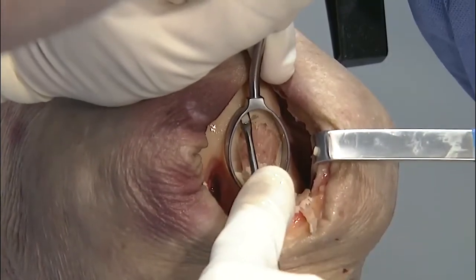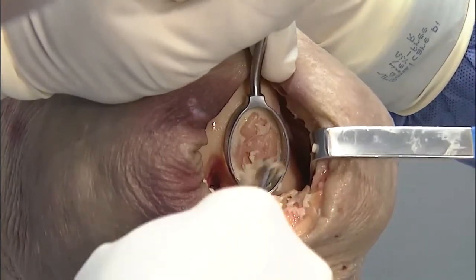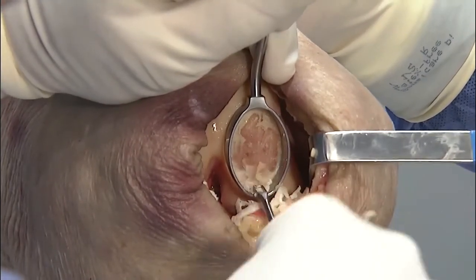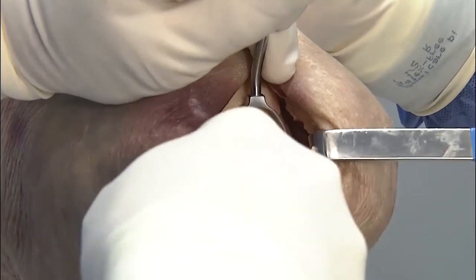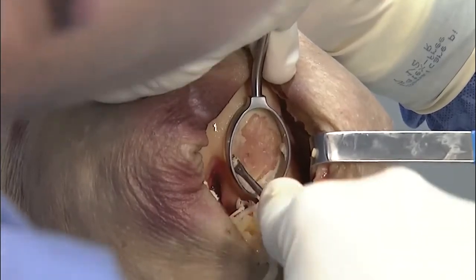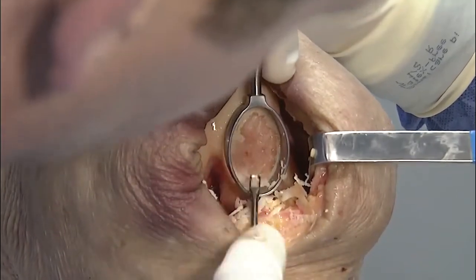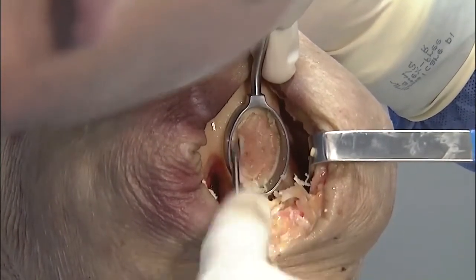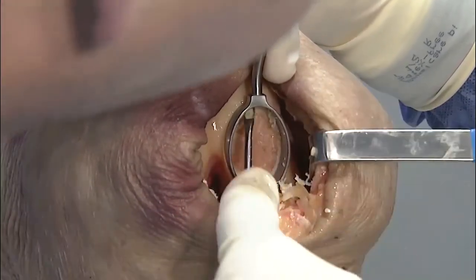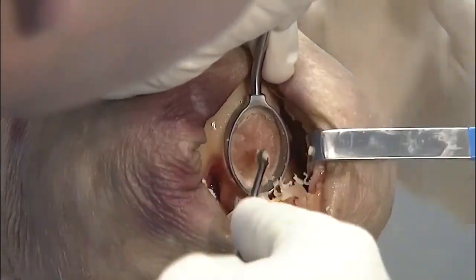So what level, I know you're going to get to it, but what level are you trying to take this down to? What are you looking for, doing too much or too little at this stage? Yeah, so I want to get down to the calcified cartilage layer just with the gross preparation. Then when we fine tune it, I want to get just through the calcified cartilage layer, but I don't want to get into any bleeding bone. We've worked hard to grow nothing but these cartilage cells in the membrane. We don't want any fibrous ingrowth between our implant.